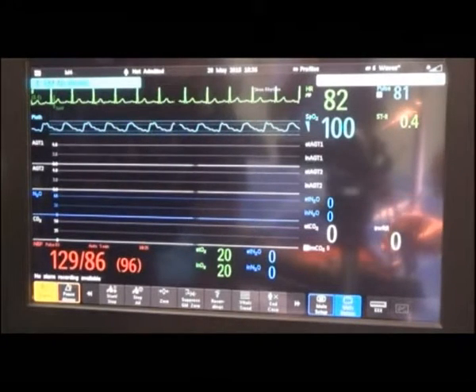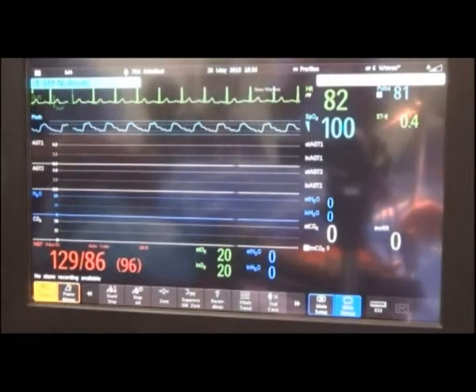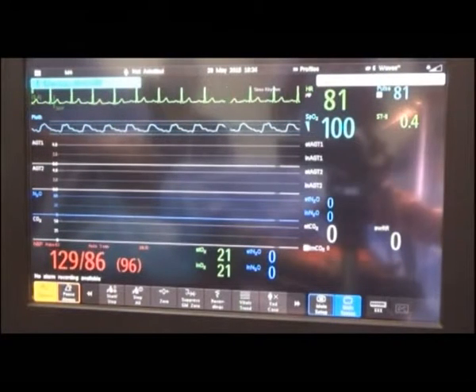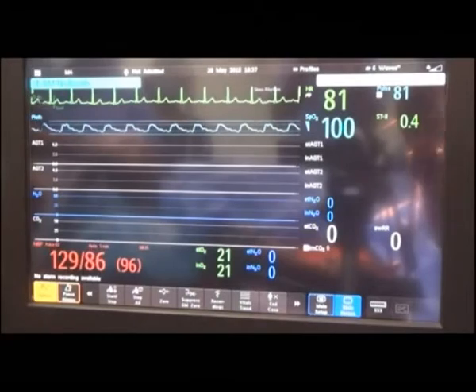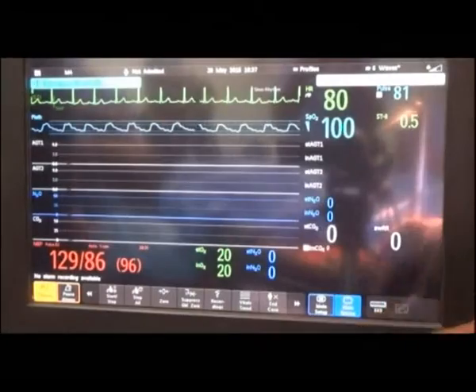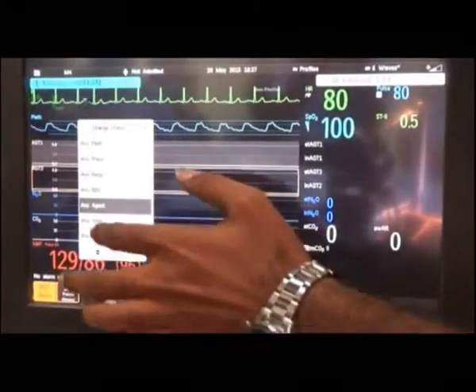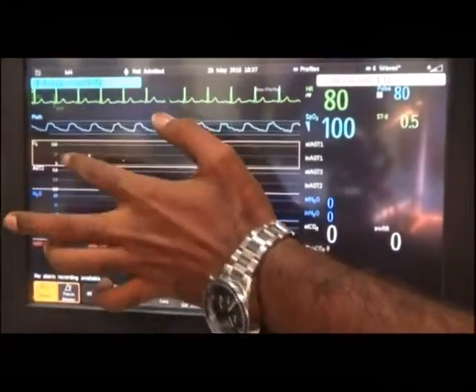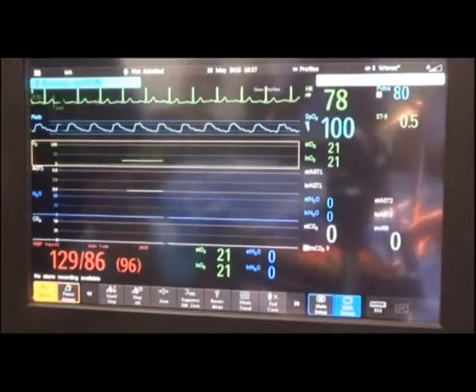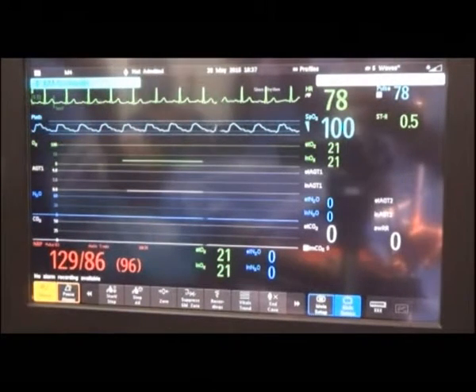So now we are pre-oxygenating the patient, and there are a lot of ways of confirming optimal pre-oxygenation. The best way is to basically look at expired FiO2. You don't have it here, but that's another way. So you have inspired and expired. What's the flow rate of oxygen? You can increase it a little bit.